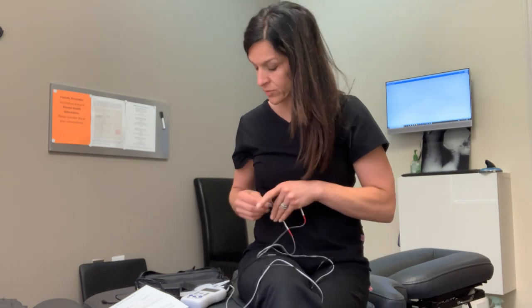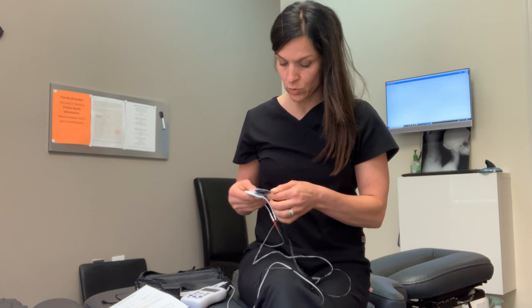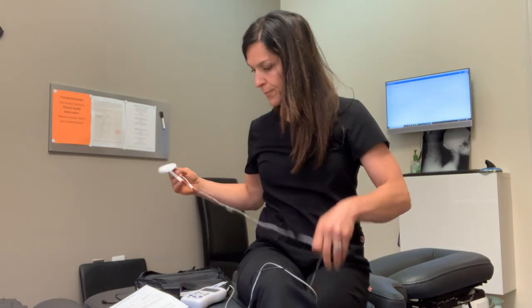One final tip: if you are somebody who uses a lot of lotions or things on your skin, take rubbing alcohol and wipe off your skin first. Let it air dry, then put the pads on. Lotions will decrease the adhesiveness of these pads pretty quickly, so try to save your pads for as long as you can. And that's the NMES setting — hope that helps.